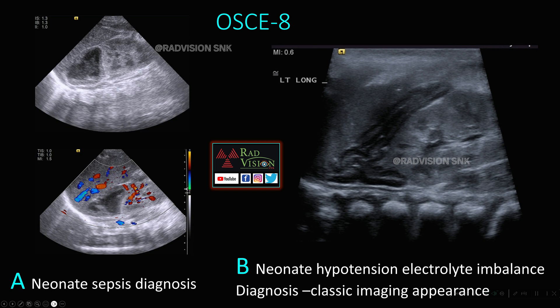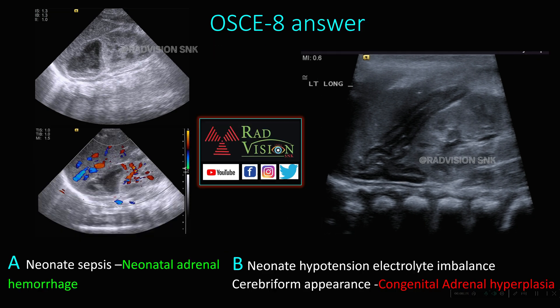Next, OSCE 8. There are two cases: A — a neonatal sepsis case, and B — a neonatal hypotension with electrolyte imbalance case. In the neonatal sepsis case, you can see a hypoechoic mass noted in the superior pole location of the kidney — this is classical of neonatal adrenal hemorrhage, which commonly occurs in preterm infants. In the neonatal hypotension case, the whole adrenal is enlarged with a cerebriform type of appearance — the adrenal convolutions resemble cerebral parenchyma with gray and white matter. This cerebriform appearance is seen in congenital adrenal hyperplasia.